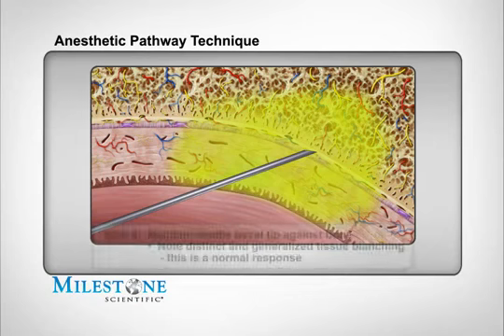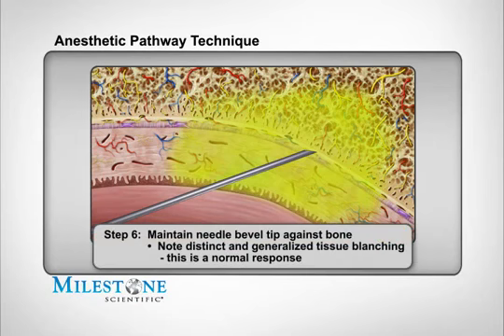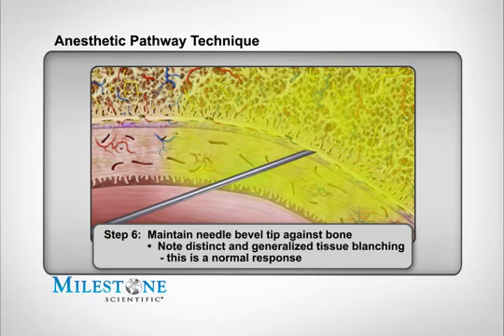Step 6: Maintain the needle bevel against the surface of bone once contacted. You should begin to notice distinct blanching of the palatal tissue as an effect of the vasoconstrictor in the local anesthetic. This is normal. When you've delivered the required dosage, you can remove the needle.